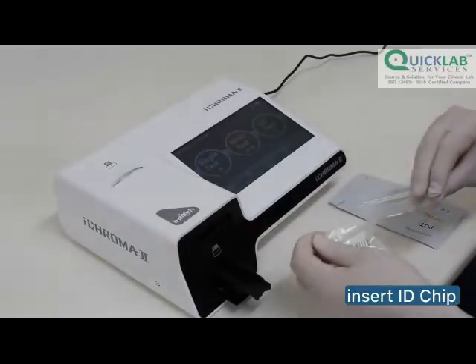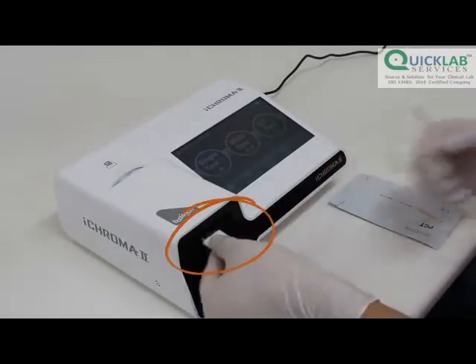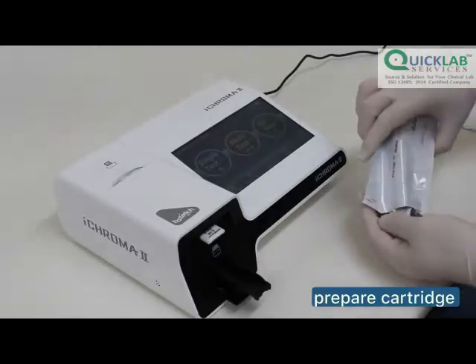Insert the ID chip into the ID chip port. Prepare the cartridge for testing.